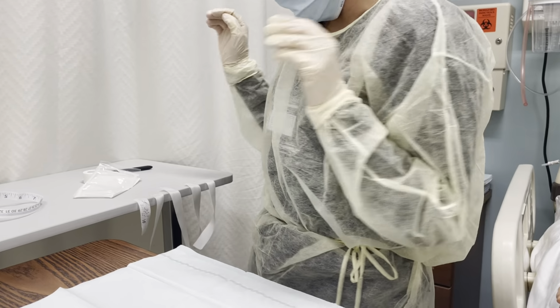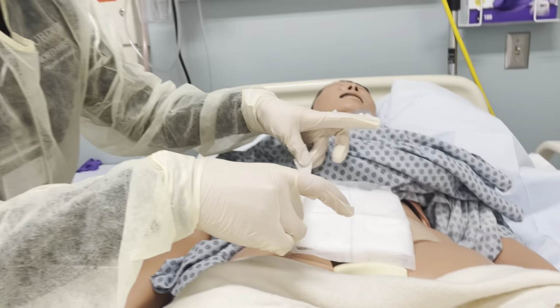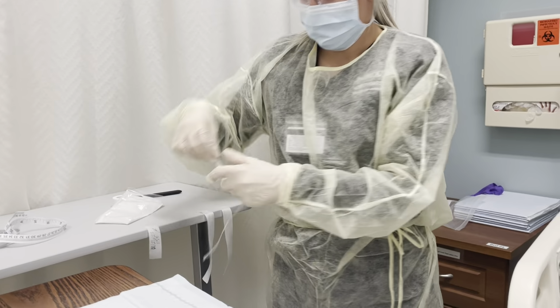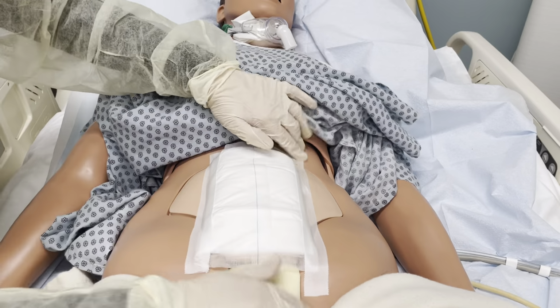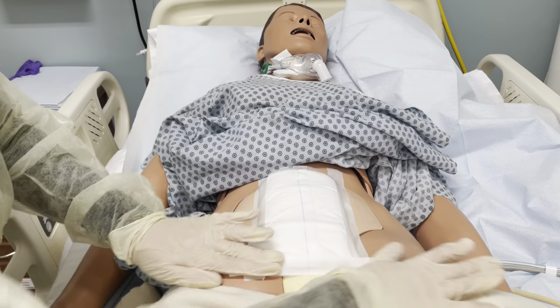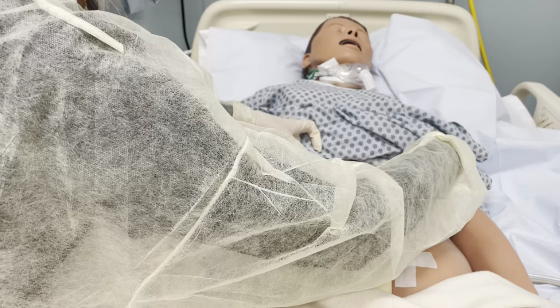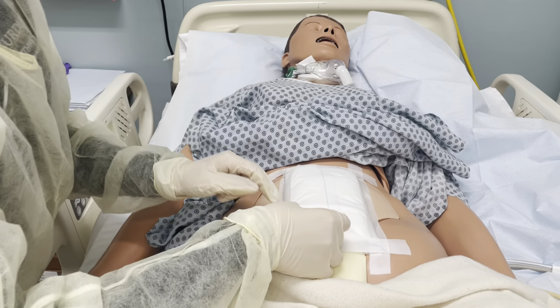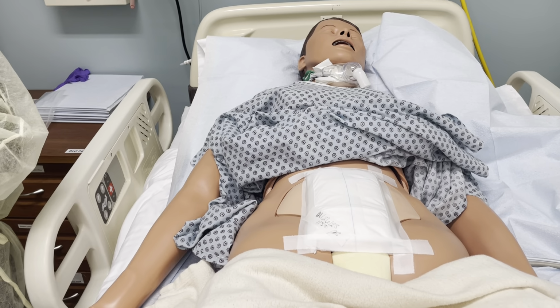and then I'm taking my 4 pieces of tape and applying it to all 4 sides. So 1, and then 2, and then 3, and then 4. And then I'm going to take my tape that has my initials, date, and time on it and just stick it right on there. Okay, and now I'm going to remove my sterile gloves.